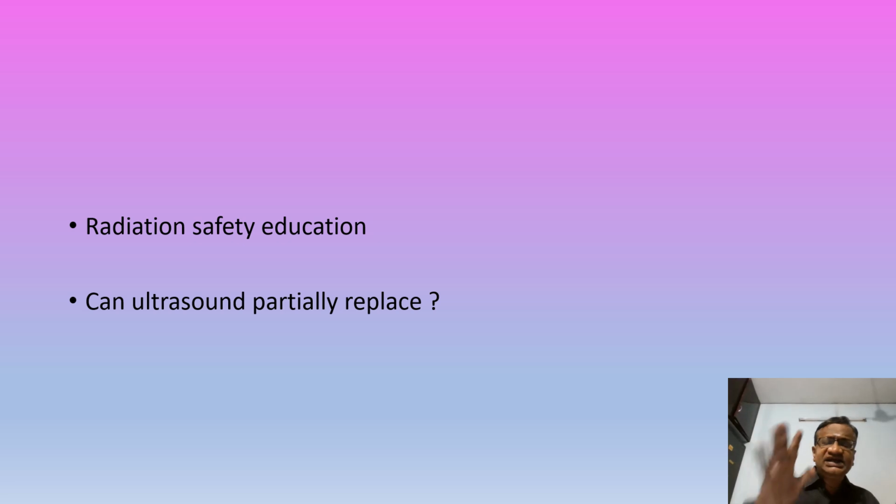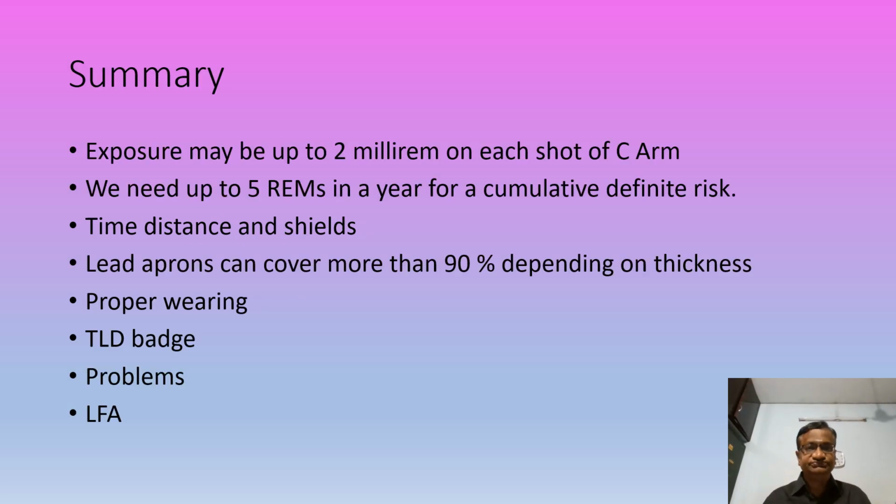They have proved that radiation safety education is important, and if they are well educated about radiation, the radiation is less. So it is essential to educate about how many millirems, how many rems, how much you are exposed, how much your thyroid, breast are exposed. All these things should be told. And we should know, can ultrasound partially replace these things? For example, CT guided biopsy, can we do it under ultrasound? If CT guided or fluoroscopic guided some blocks, can we replace them with ultrasound?